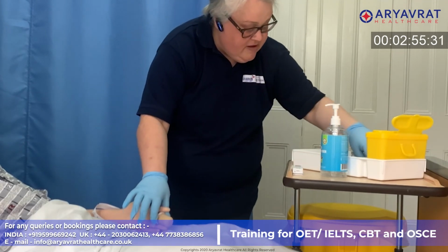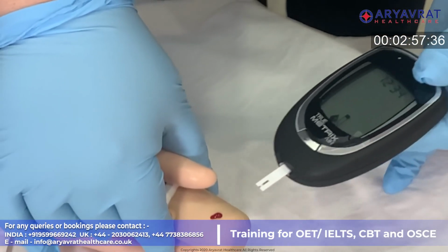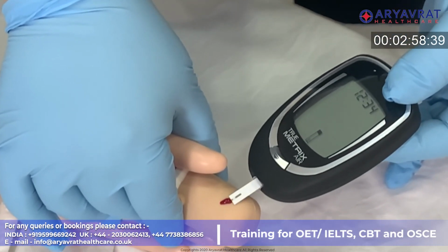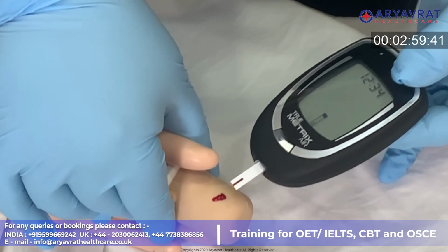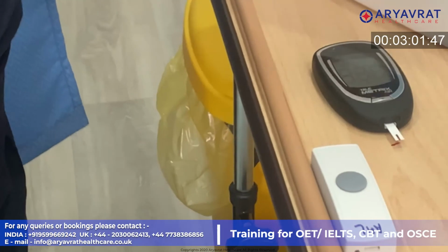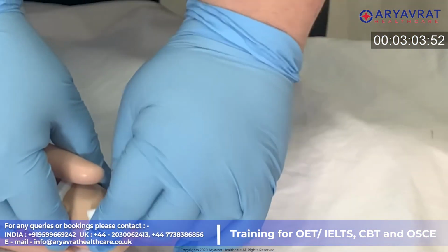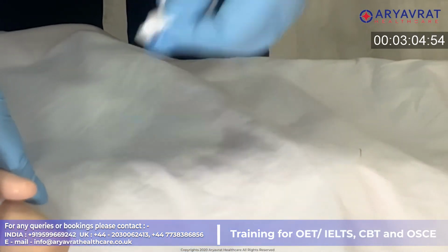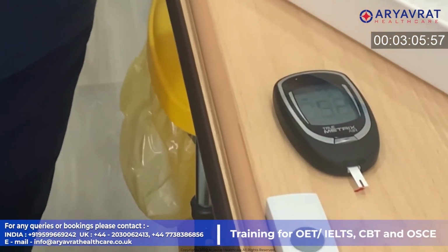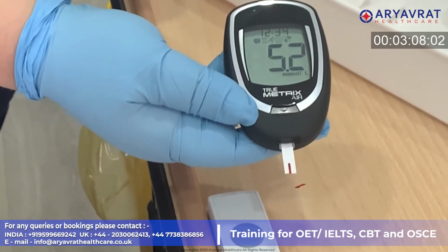Okay, and just give it a moment. There we go, let's line that up there, and that's sucked up the blood that it needs, and it's working. So let's wipe your finger, making sure you've stopped bleeding.